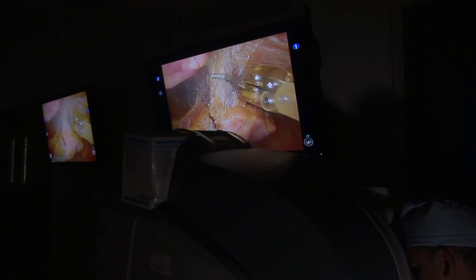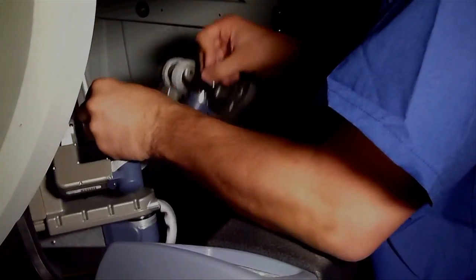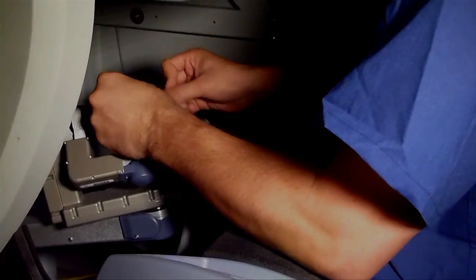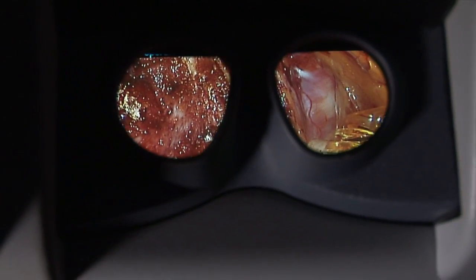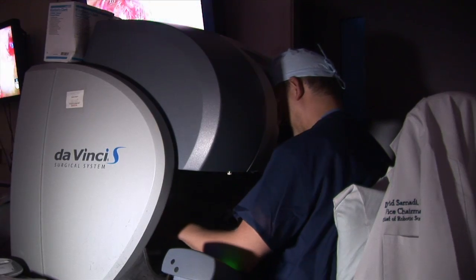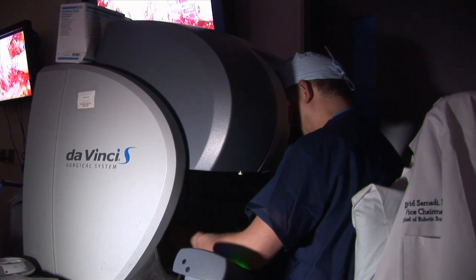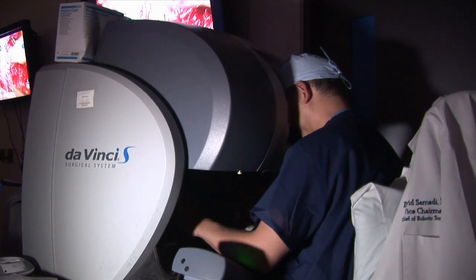As you can see, there's no blood in the field. If there's no blood in the field, I don't need to have my hands there because I can see exactly what's going on. As a result, you can do a much more precise operation than rushing the way we used to in open surgery.